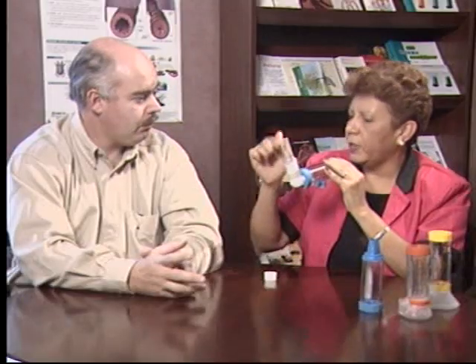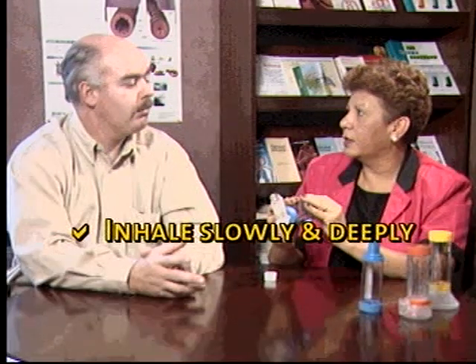And that's only one puff. If you need to take a second one, we have to wait at least one or two minutes. And then you start again from the beginning, shaking the inhaler, putting it together, and then emptying your lungs, putting the aero chamber in your mouth, releasing one puff, and then taking it slowly again. Be sure to inhale slowly and deeply.